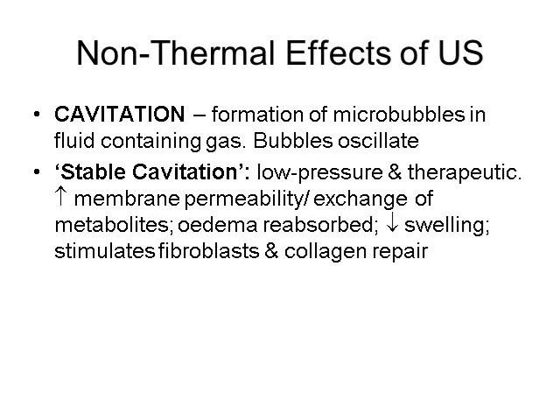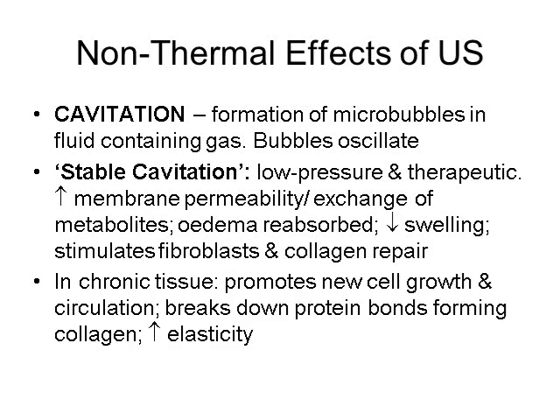Stable cavitation involves low pressures and is beneficial. It has been reported to increase cell membrane permeability and thereby the chance of metabolites to reduce edema, and to stimulate fibroblasts in their role in repairing and laying down new collagen. In chronic conditions, cavitation has been reported to stimulate new cell growth and circulation, to break down adhesion formation, and to increase the tissue elasticity.